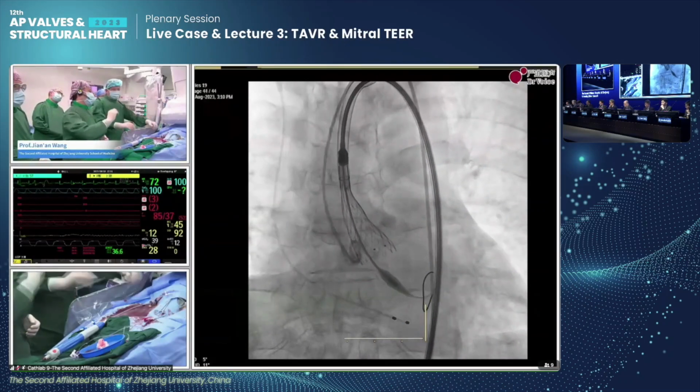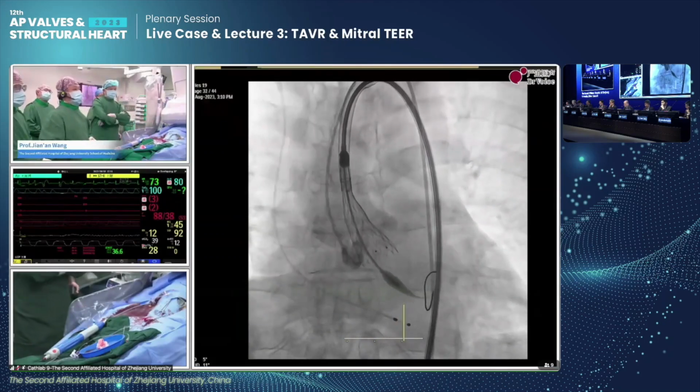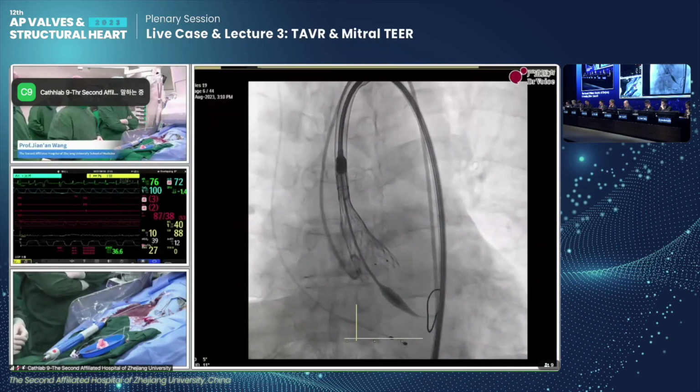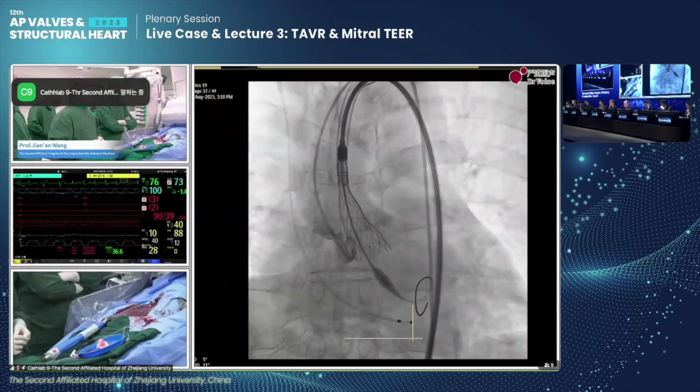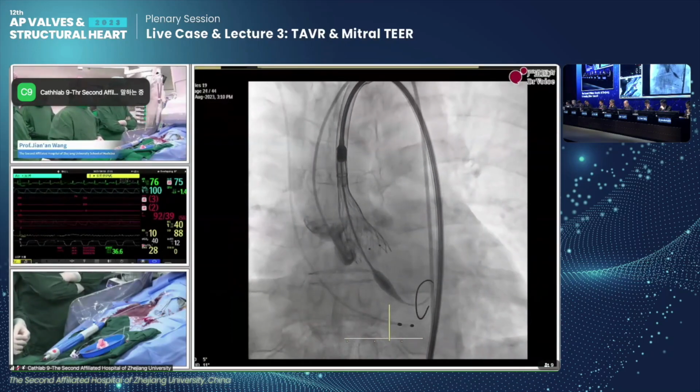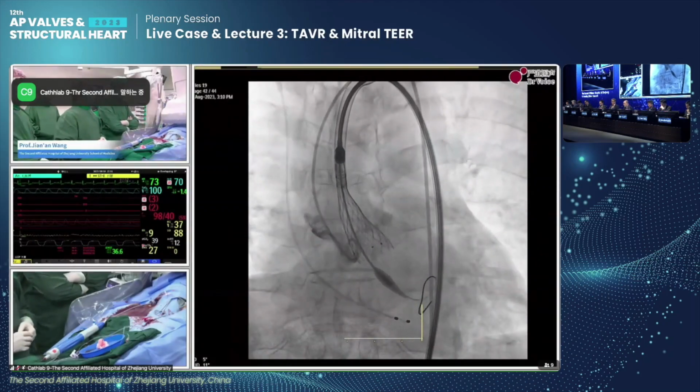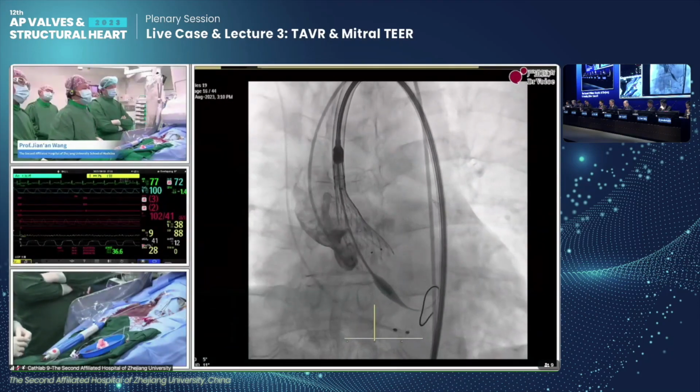I think we can go higher still. Professor Park, now we lift the device a little higher compared with the previous one, possibly 2 millimeters higher. But Dr. Liu suggests going a little higher again. So what is your comment?